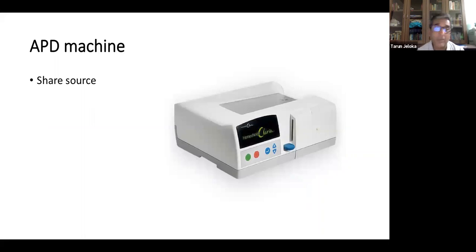through certain table vivas. So APD machine, this is the most advanced APD machine. There are older versions as well. So this is what an APD machine looks like. When you get an APD machine, they may ask you, how do you program it? What you feed into this so-called computerized system is the total volume of exchange.